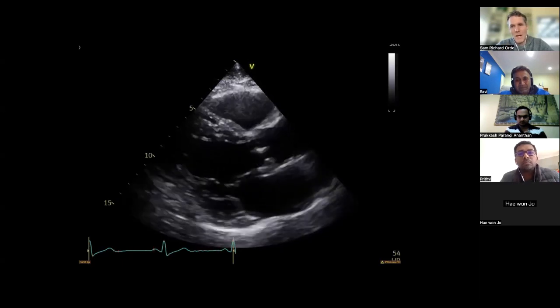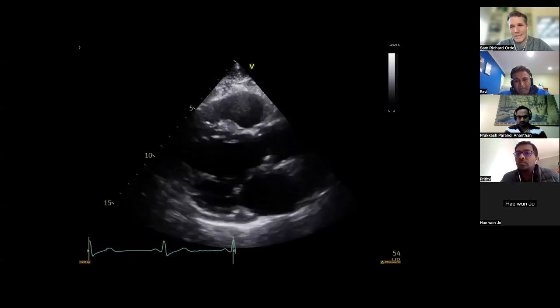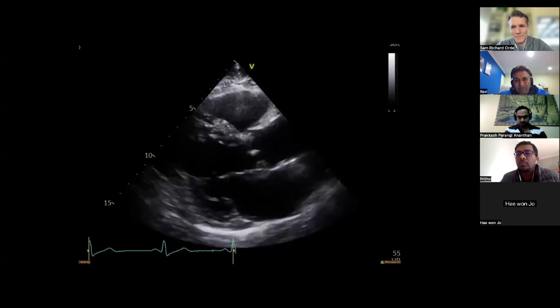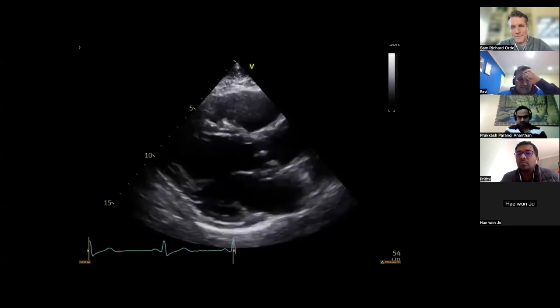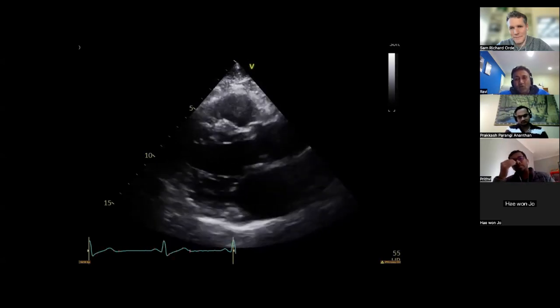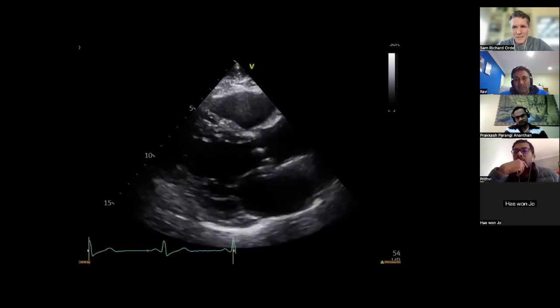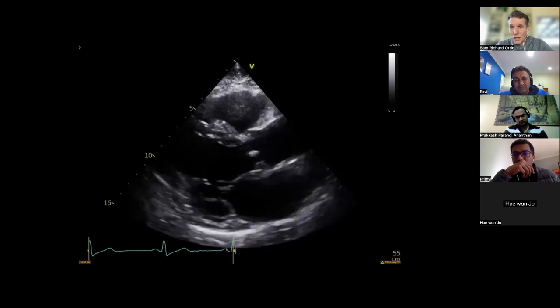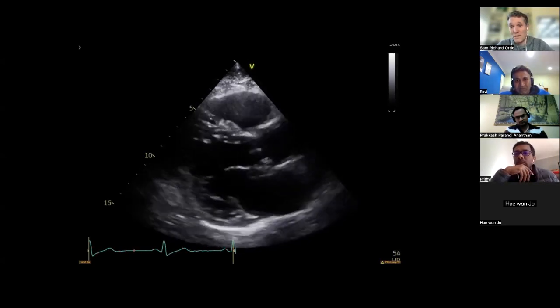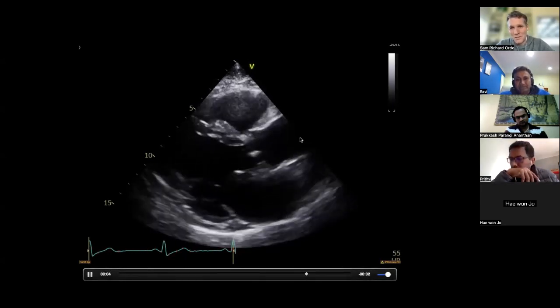That's great. Some of the questions that we'd ask then are about acute versus chronic ischemia. So how do you tell the difference between acute and chronic ischemia? One of the things will be, in chronic, the wall will be thinned out, scarred, very bright. So that would suggest chronic. Very nice. And so acute, conversely, might be someone who's got normal thickness walls with some akinesis or hypokinesis.